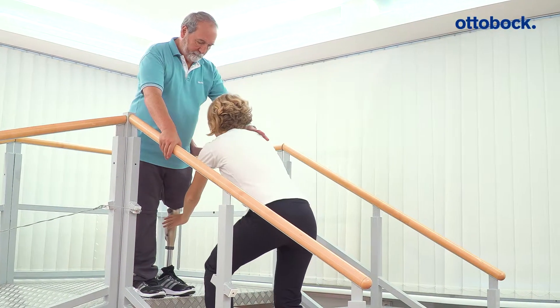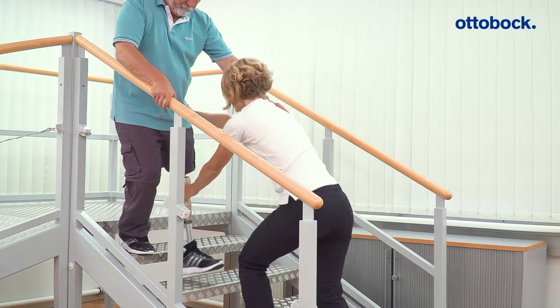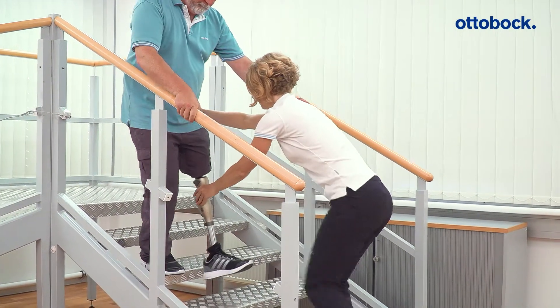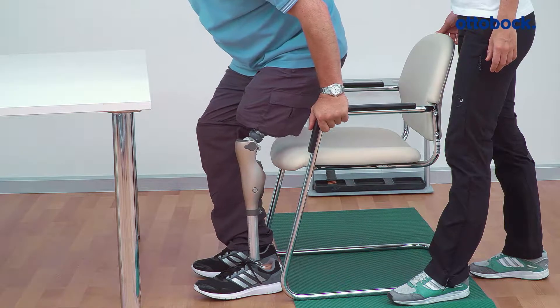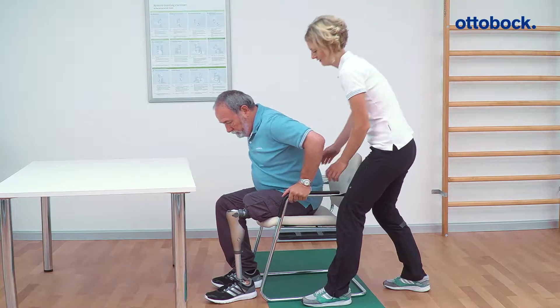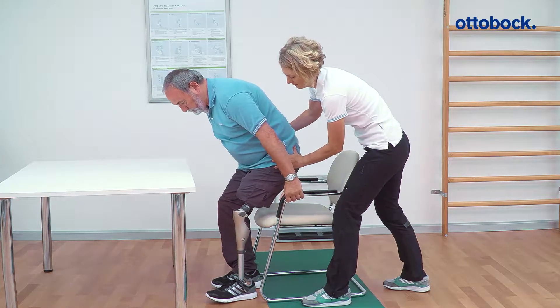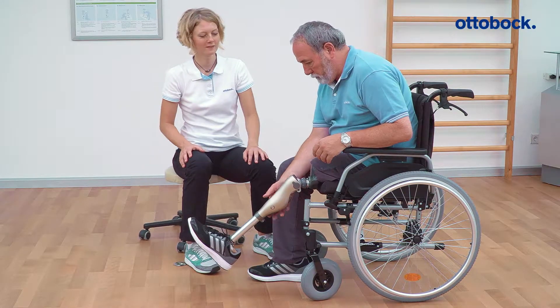In modes A, B, and B+, it is not possible to descend stairs step over step. Basic features such as supported sitting down, standing up, and the wheelchair function are available in mode B.